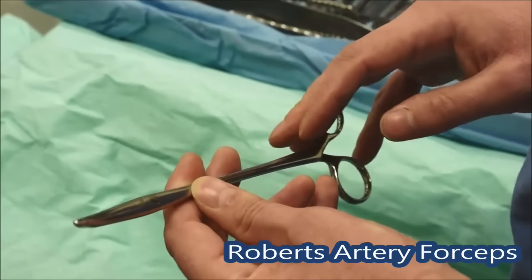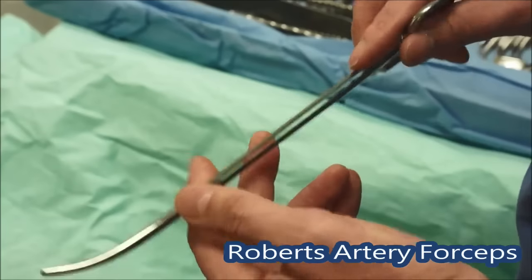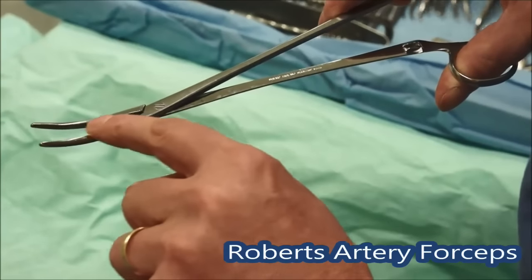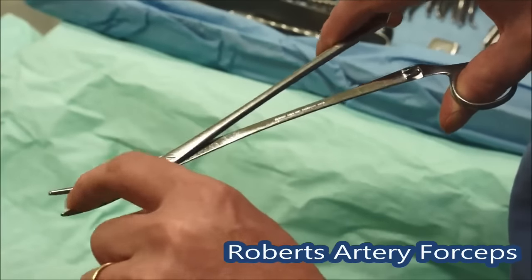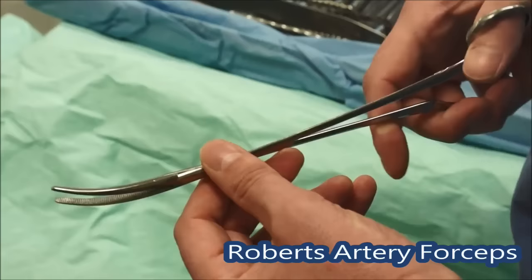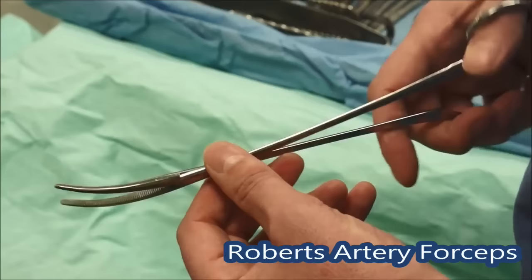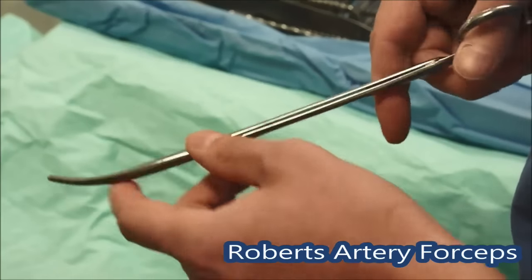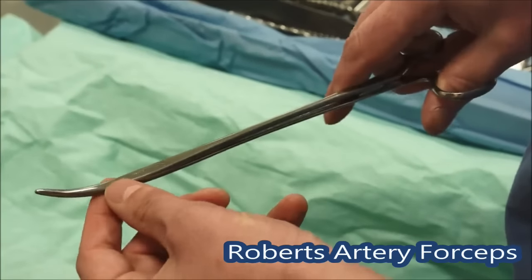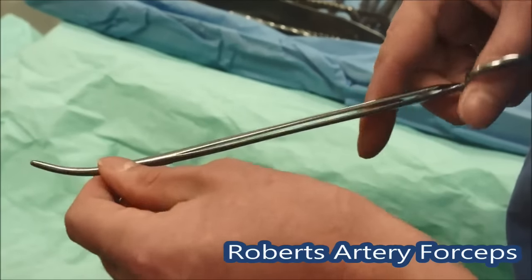This one is really the workhorse of the clip, certainly in abdominal surgery — it's called the Roberts and it's quite long. It will go down deeper holes and it's got quite long jaws on the end with some teeth inside. This is the instrument used to go across large named vessels — the ileocolic, the inferior mesenteric artery, et cetera. You put two of these on, cut between them, and then with large vessels probably transfix underneath. Again it's curved, so you can get the suture underneath quite easily to tie.